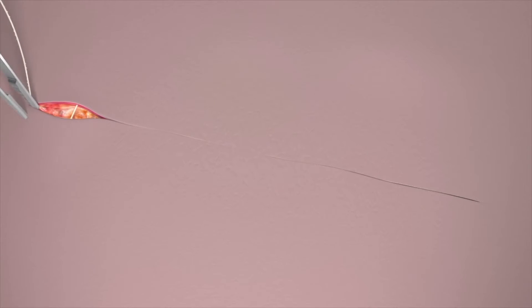To complete the closure in subcuticular tissue, take at least one pass in the reverse direction, then pass the needle across the incision and take a split thickness bite perpendicular to the incision and exit the skin. Gently pull on the free end of the device and cut flush with the surface of the tissue.